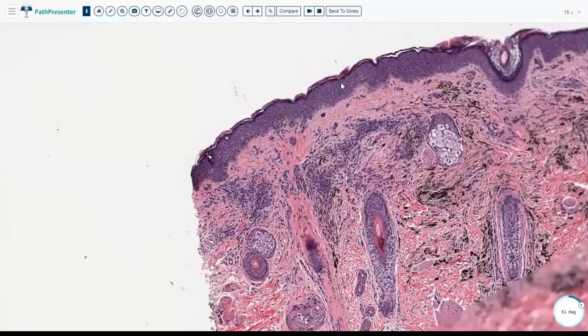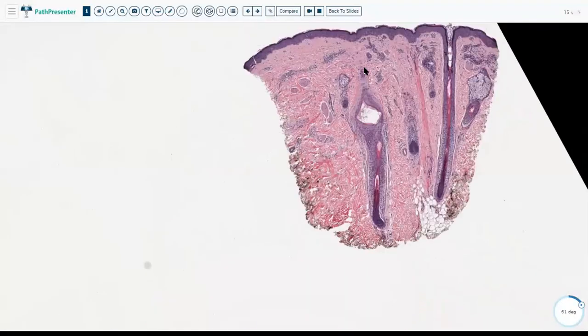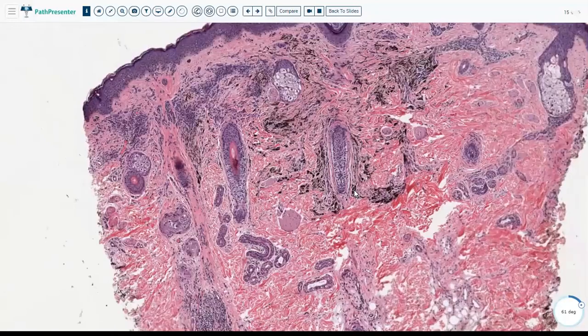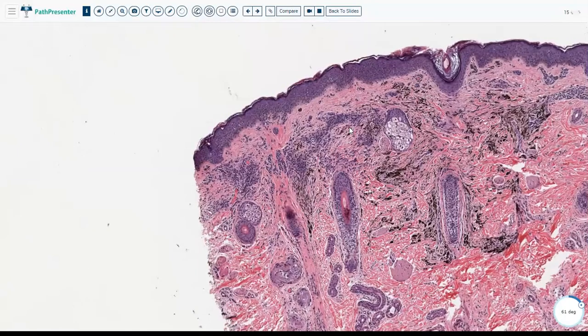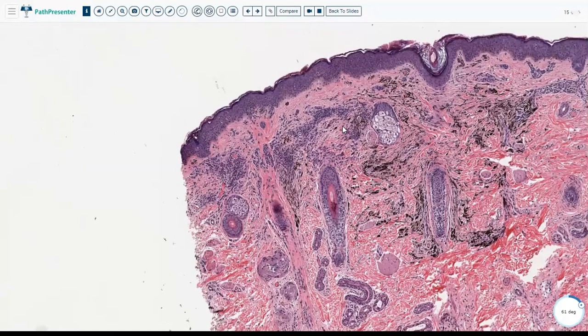So what do you call this kind of nevus? Yeah, this part shows it more. So we have a blue nevus, and we have an intradermal melanocytic nevus in one lesion. What do you call this? Is that a collision nevus? A collision nevus or a combined nevus, very often we call them. So we call them a combined nevus.